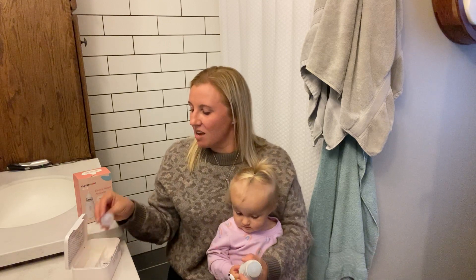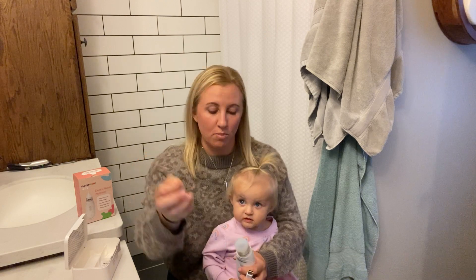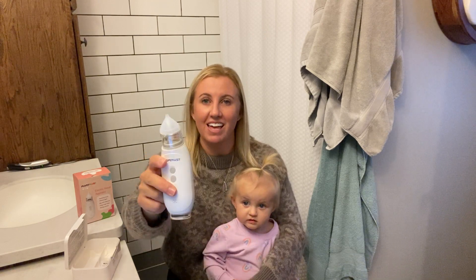Again, it has a bunch of different nasal suckers in here to fit your child's nose. If they have a more adult-sized nose, this one might be great because it's a little bit more pointy compared to the infant one. I love this nasal sucker and I hope you guys do too.